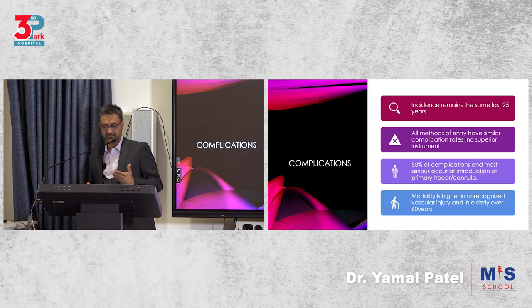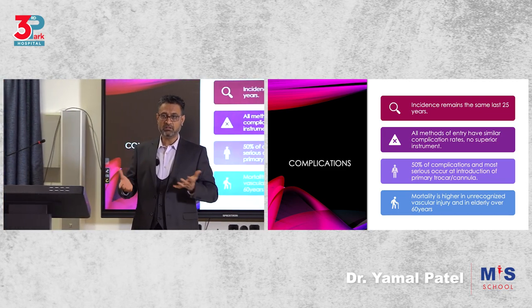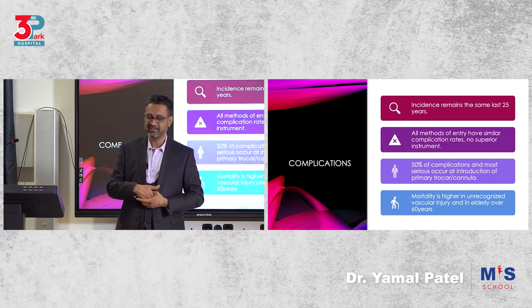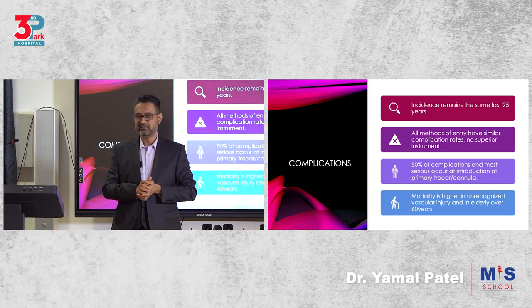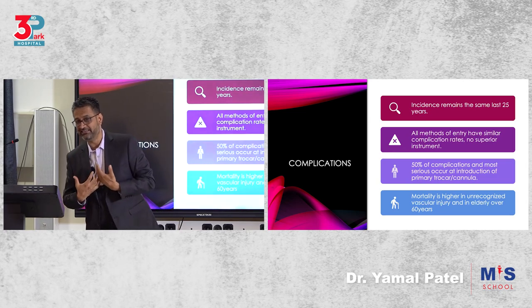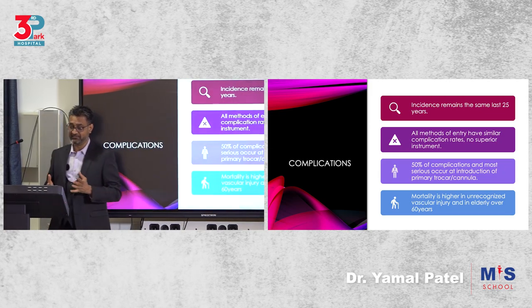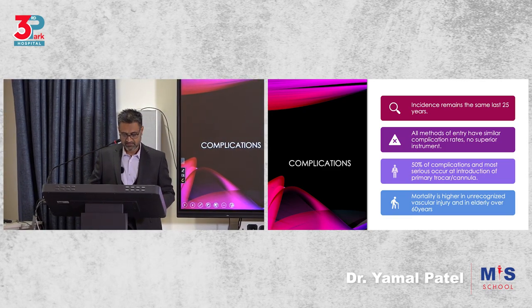This has remained similar over the last 25 years, and I would say all methods of entry are equal. So it's more of what you develop and what you specialize in. I am now, as I told you, direct trocar entry. I still have some of my mentees who are comfortable with the Veress entry. I know our surgeons in this country are very comfortable with the open Hasson's technique. So it's what you get used to. But none is superior to the other in terms of complications or risk factors.